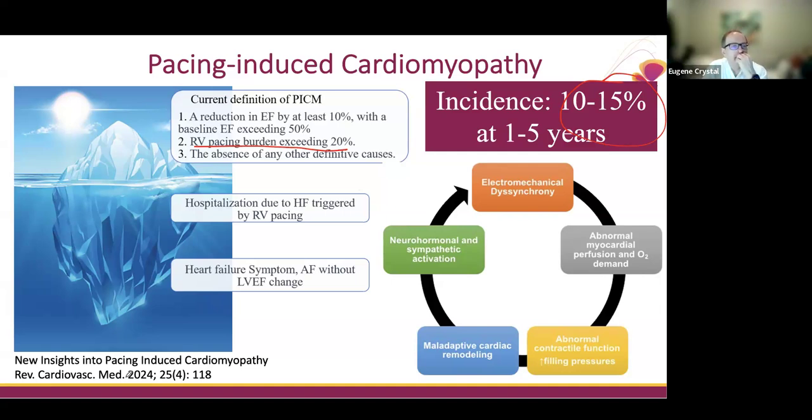Yeah, thanks. So I think it's very important to understand a few basic concepts, that we have had bradycardia treatment as right ventricular apical pacing for decades, right? And we always recognized that for a certain percentage of our patients, it's not working well, and it seems to be incremental over time. So that's one observation. The second was always that if you would start upfront in someone who is already compromised in terms of a baseline ejection fraction, the effect seems to be more devastating.